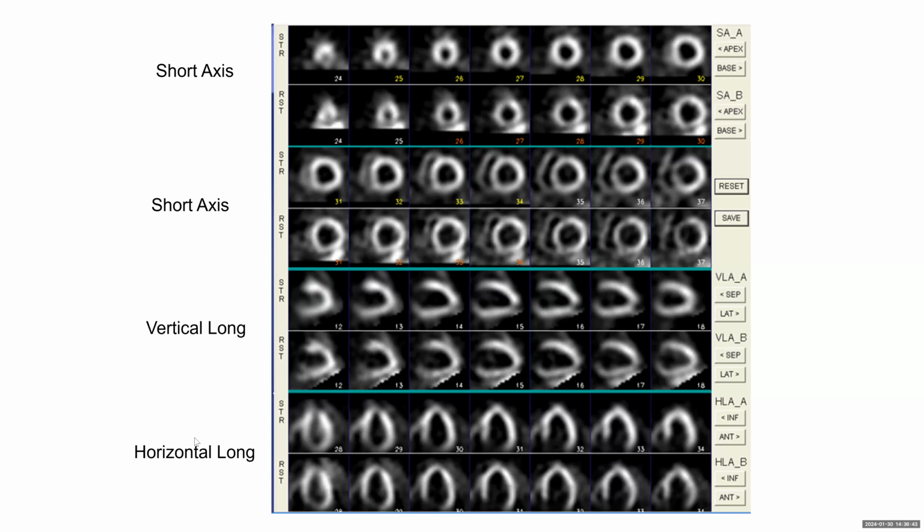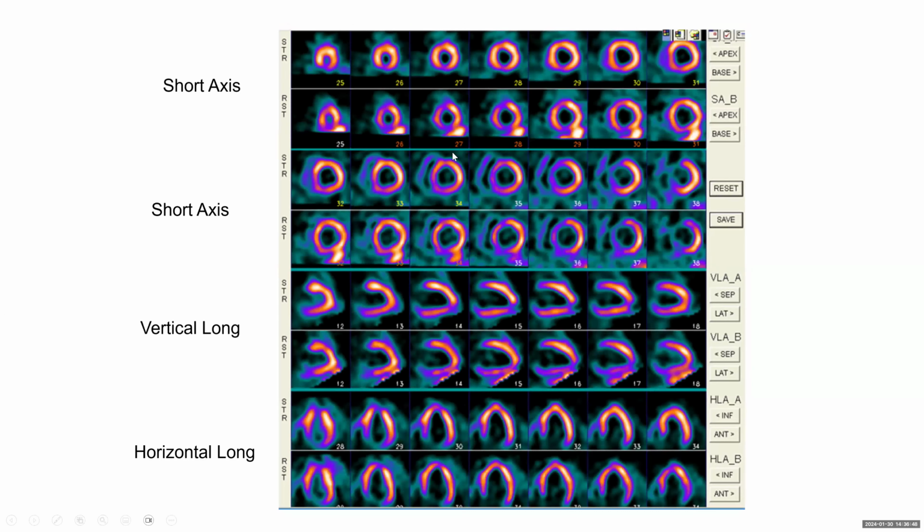Fair enough. From this study, can't we judge the patient as having non-ischemic cardiomyopathy? It's very difficult to judge patients not to have ischemic cardiomyopathy when you have evidence of dilated cardiomyopathy on stress. You have to look at the anatomy to say 100% there is no coronary artery disease as a cause of cardiomyopathy.